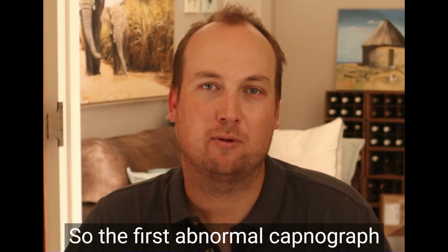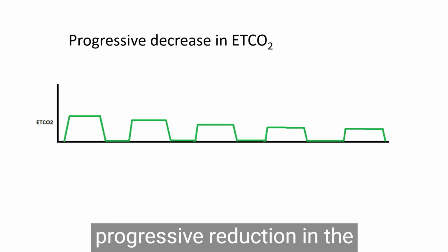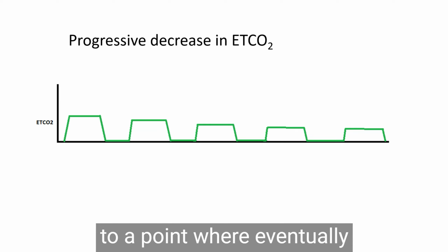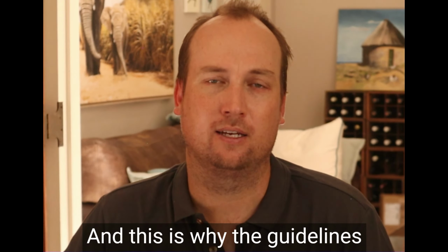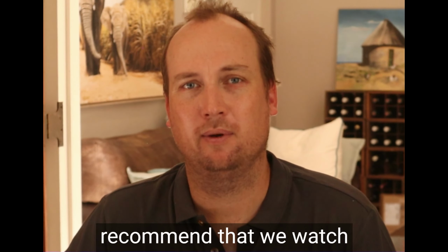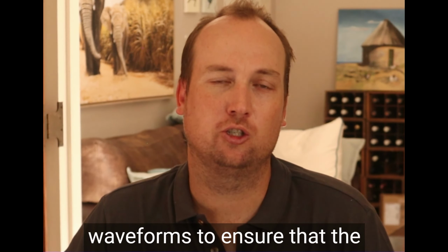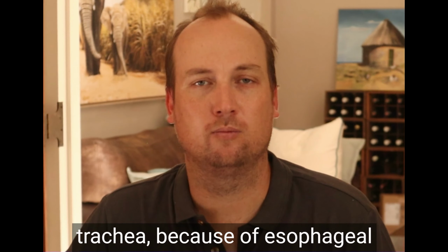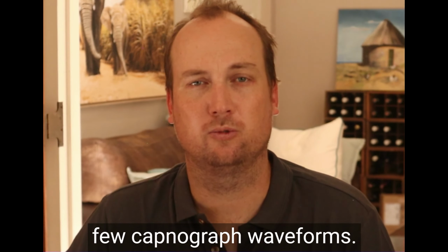So the first abnormal capnograph trace that we're going to look at is that of esophageal intubation. And what we see here is a progressive reduction in the height of the capnograph trace to a point where eventually the capnograph trace is flat. And this is why the guidelines that I've gone through earlier recommend that we watch for at least 7 capnograph waveforms to ensure that the endotracheal tube is in fact in the trachea, because esophageal intubation can still result in a few capnograph waveforms.